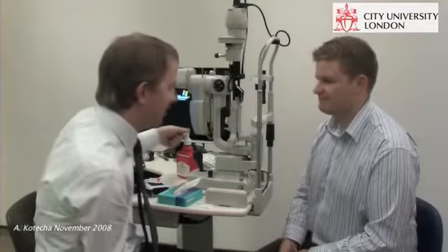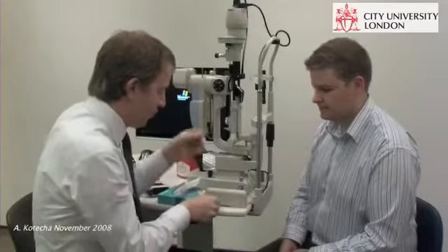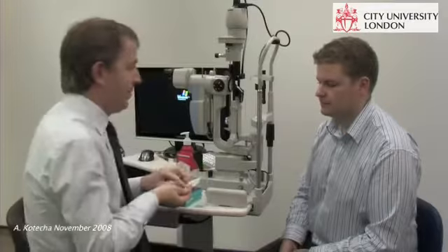Hello, I'd just like to check the thickness of your cornea, starting by putting a drop in which will numb the front of the eye. So if you could just look up, it may sting a little. And here's the tissue. If you could just hold it there in the corner.